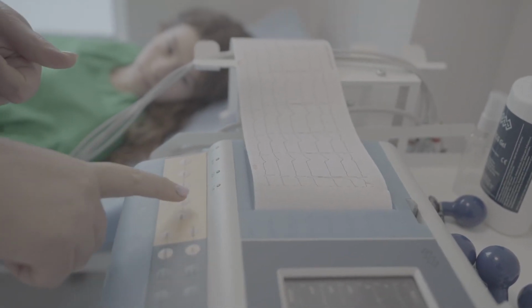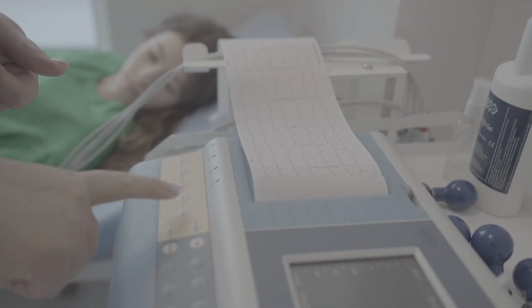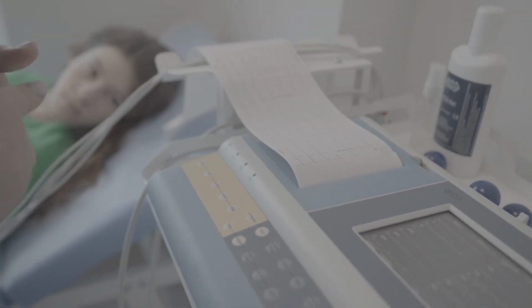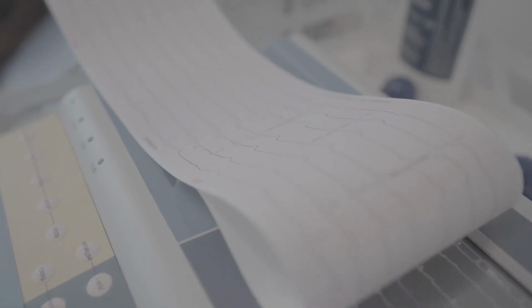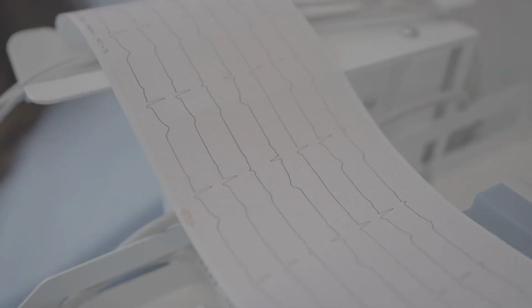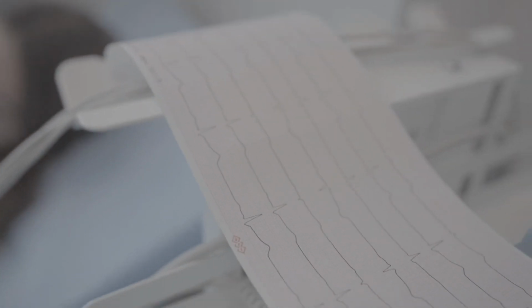ECG recording. Once all the electrodes are properly placed and connected, the ECG recording begins. The machine measures and records the electrical signals from the heart over a short period, usually a few seconds to a few minutes. Analysis and interpretation.